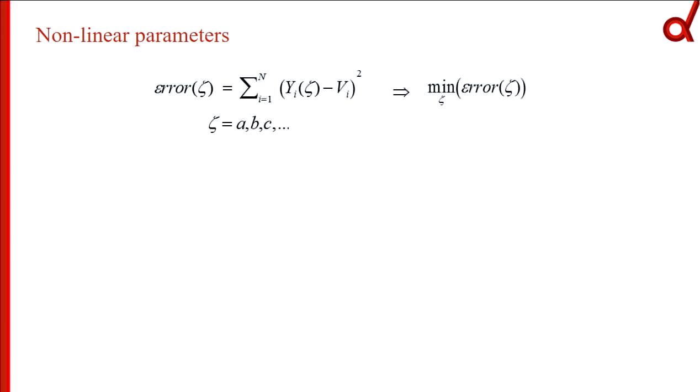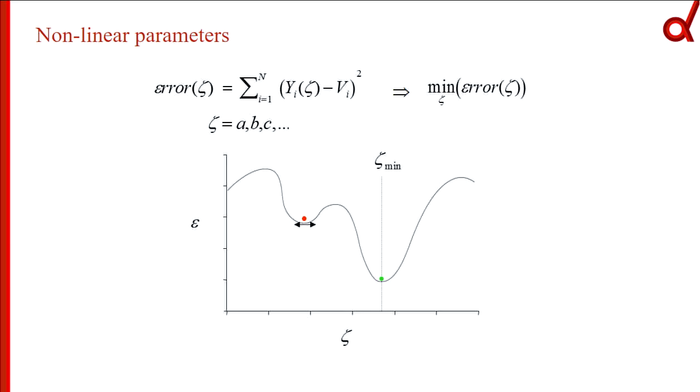To make it more complicated, let's say we now have an error term, which is basically our model minus the real data. What we want to see is how close it gets, or whether it's far away. So we plot the parameters we choose in our model against the error that we get, the difference between real data and model data. What we want to get to is the green point, because the green point is the lowest error. This is where the data is mostly explained.